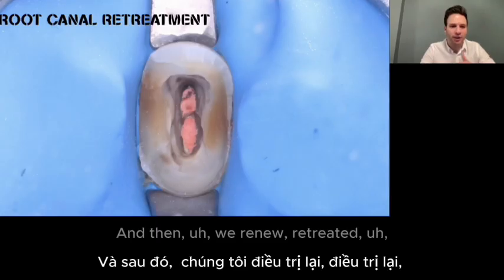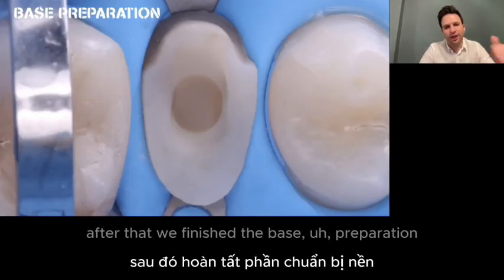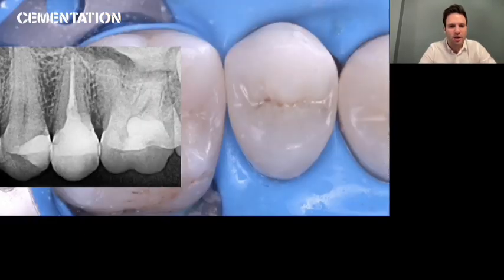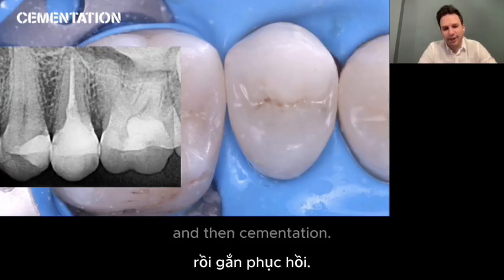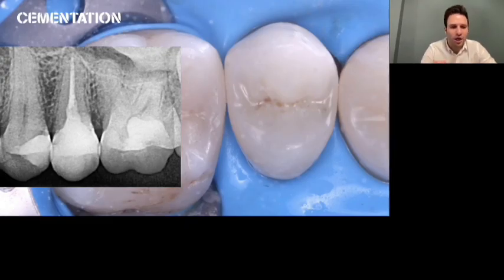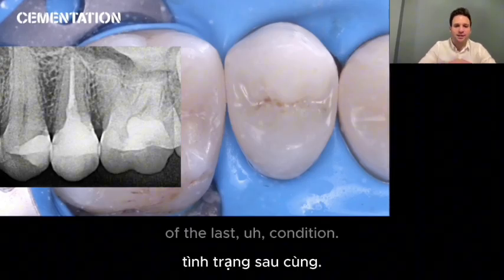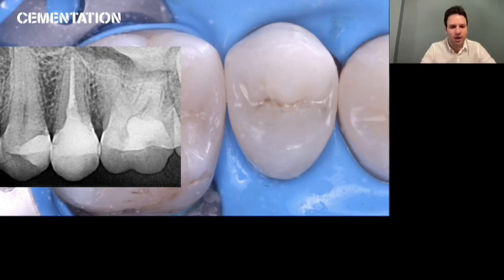And then we treated the root canals, and after that we finished the preparation and then cementation. And after cementation, like for direct restoration, we must take an X-ray of the final condition.